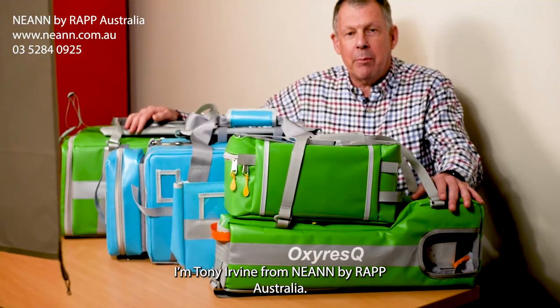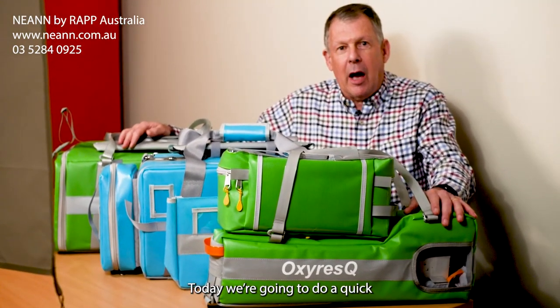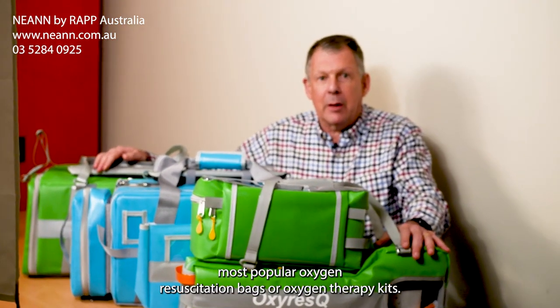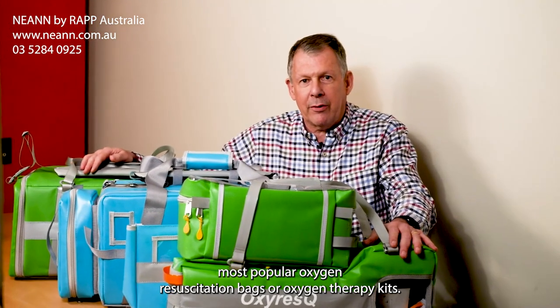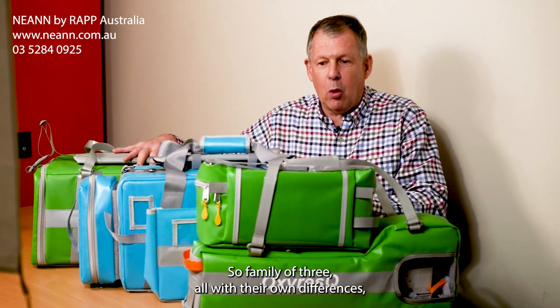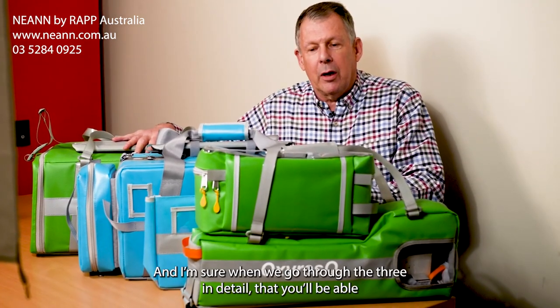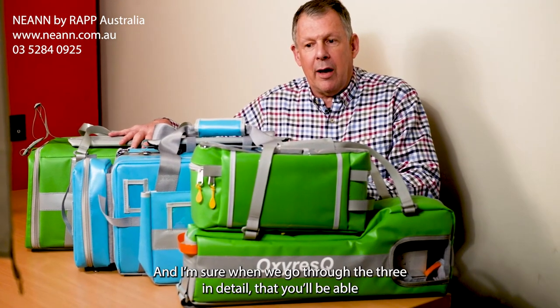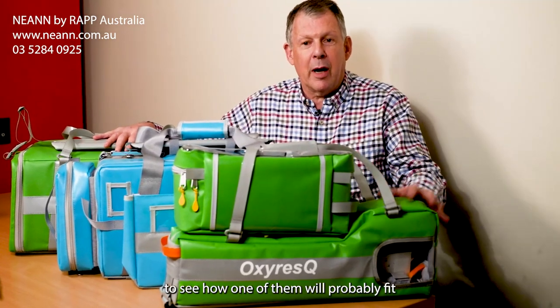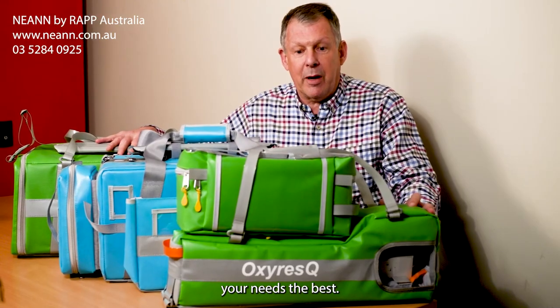I'm Tony Irvin from NEANN by RAPP Australia and today we're going to do a quick but fairly detailed overview of our three most popular oxygen resuscitation bags or oxygen therapy kits — a family of three, all with their own differences and advantages. When we go through the three in detail, you'll be able to see how one of them will probably fit your needs the best.